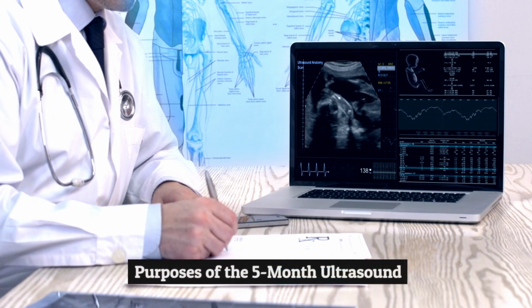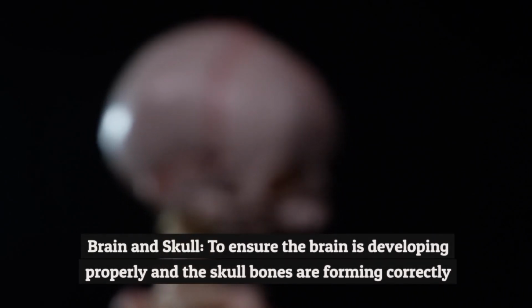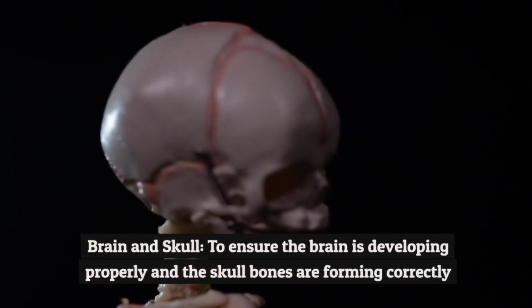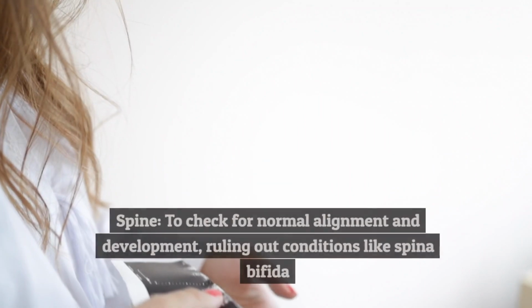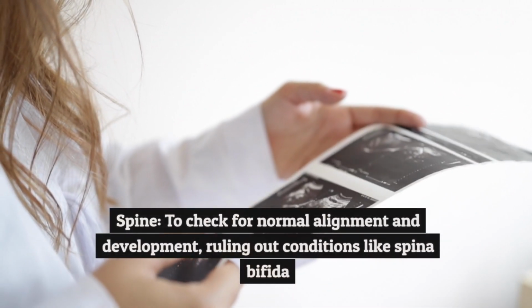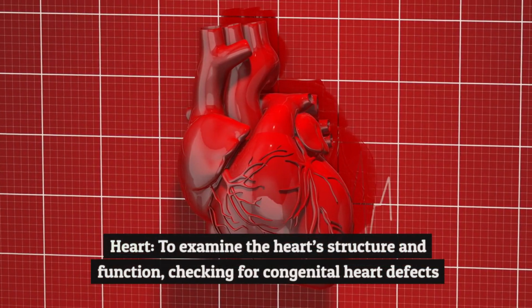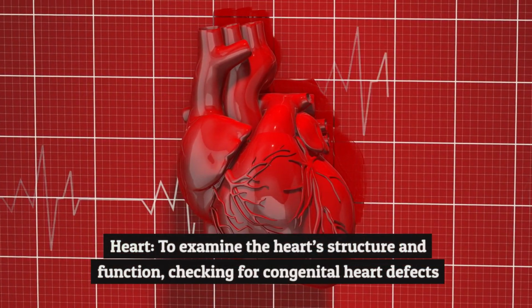Purposes of the 5-month ultrasound. Number 1, anatomy check. Brain and skull, to ensure the brain is developing properly and the skull bones are forming correctly. Spine, to check for normal alignment and development, ruling out conditions like spina bifida. Heart, to examine the heart structure and function, checking for congenital heart defects.